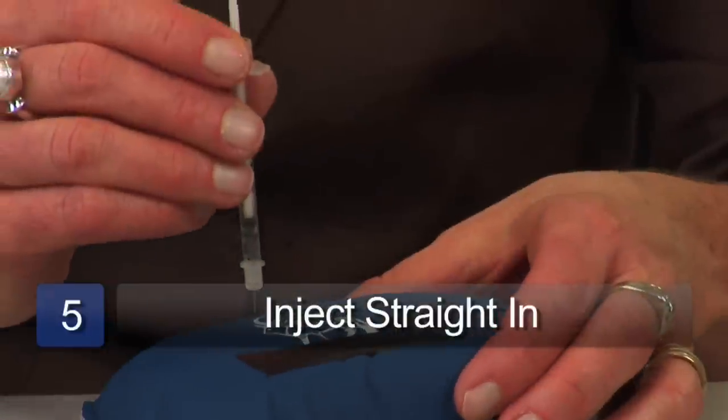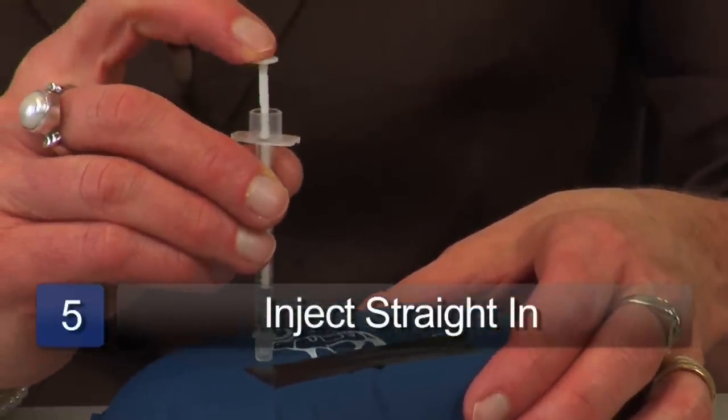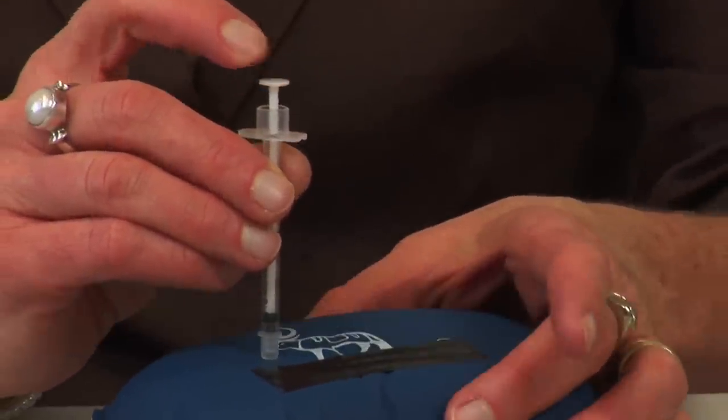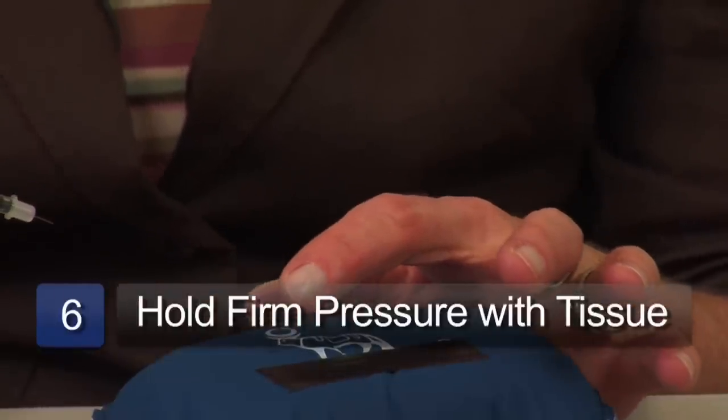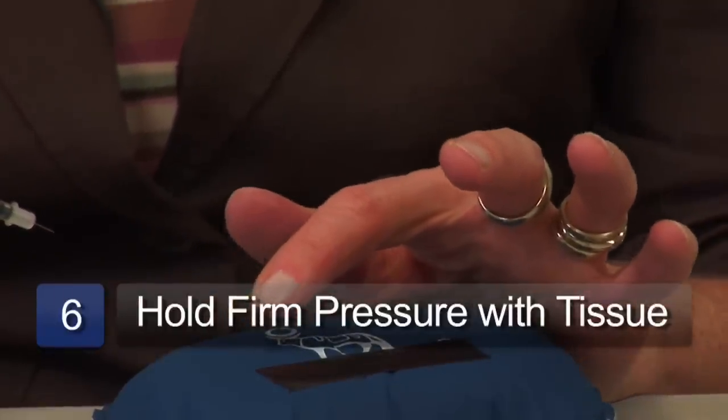Once we get the insulin drawn up, we go to our body. We can inject insulin in the belly, the arms, the thighs, and the buttocks — best in the belly. We can either pinch the skin or leave it flat, go straight in, inject the insulin, pull the needle out, and hold firm pressure with a clean tissue to prevent any bleeding or bruising.